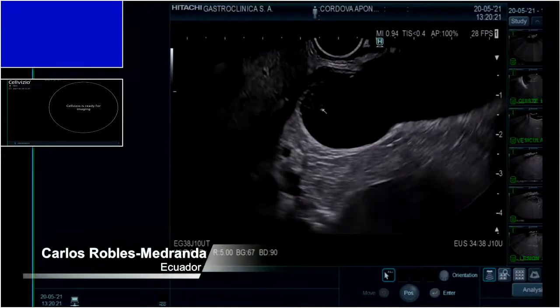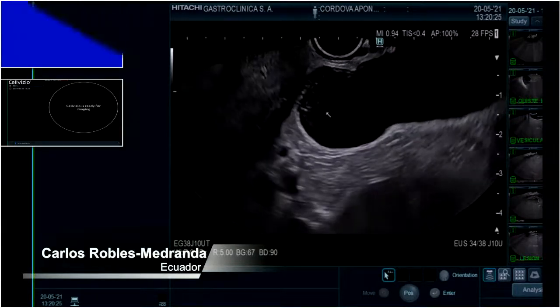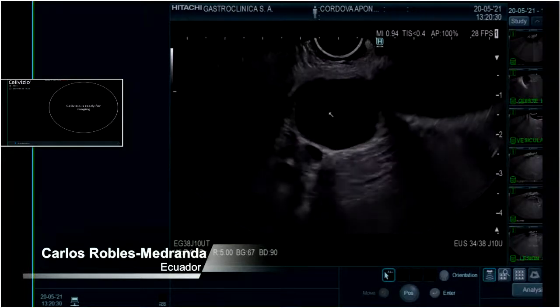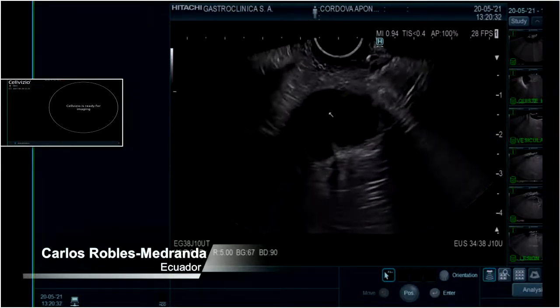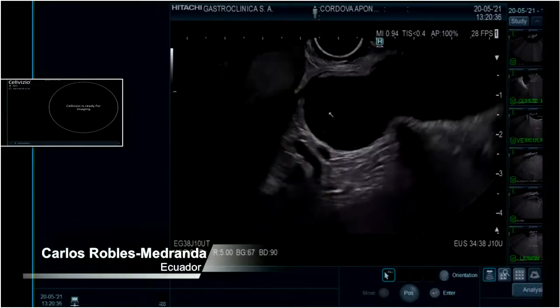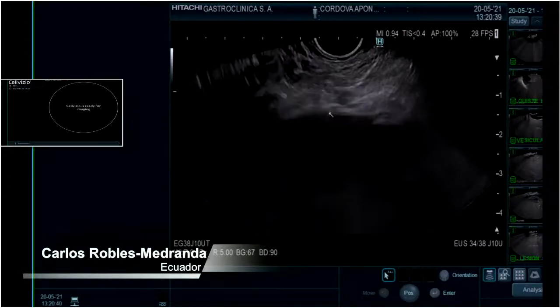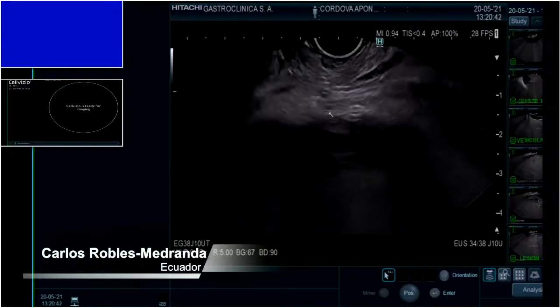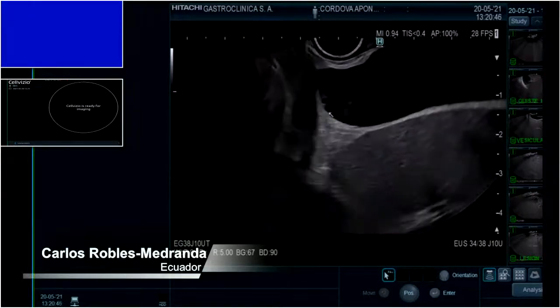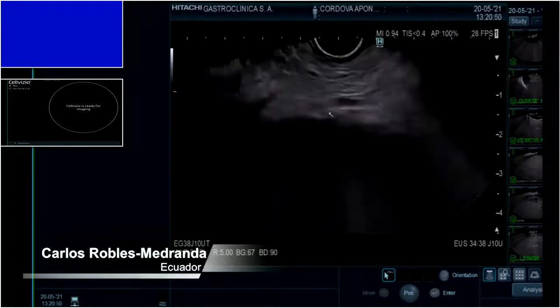Look here. So probably this patient was not that so easy to have access to big centers or hospitals where they can be evaluated very well.